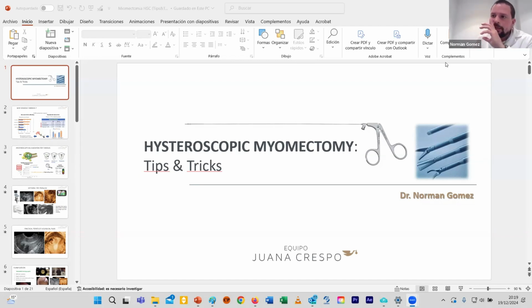But there is one thing that I do if I have a lot of fibroids, maybe 5 fibroids. I start to detach fibroids, and during the surgery I decide to continue or not, and the decision is based on the liquid input.